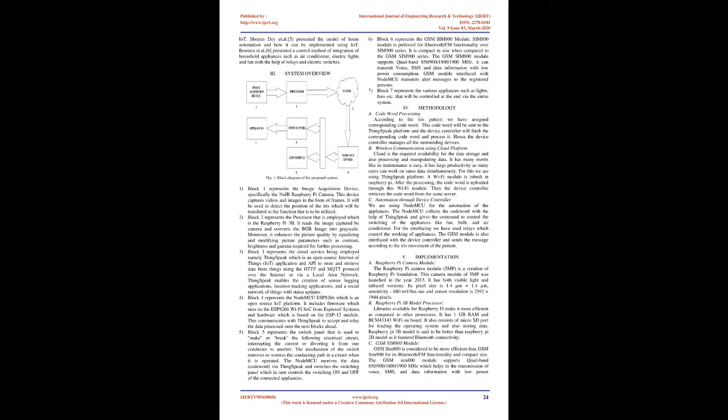4. Block 4 represents the Node MCU ESP8266, which is an open-source IoT platform. It includes firmware which runs on the ESP8266 Wi-Fi SoC from Espressif Systems, and hardware which is based on the ESP12 module. This communicates with ThingSpeak to accept and relay the data processed onto the next blocks ahead.